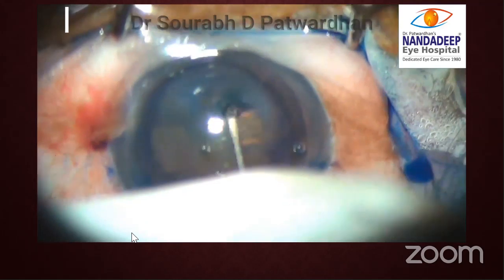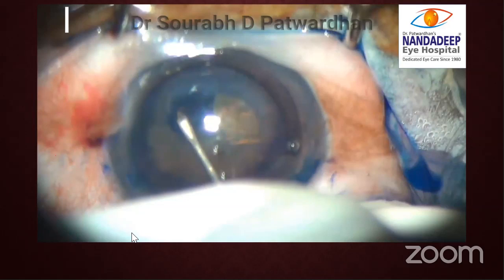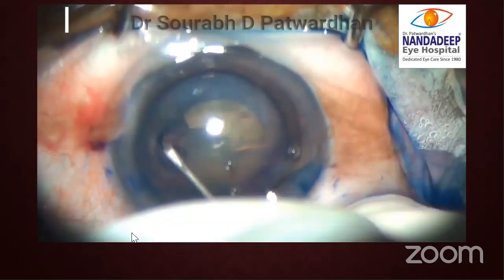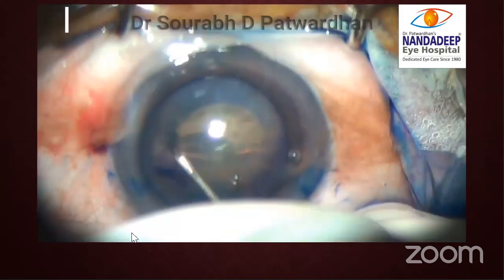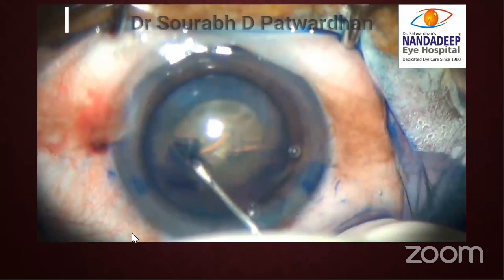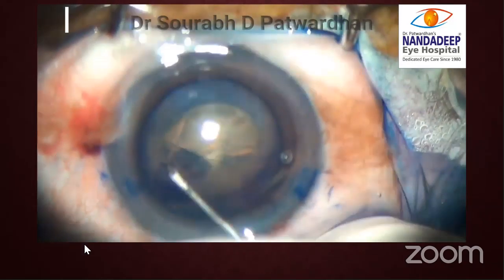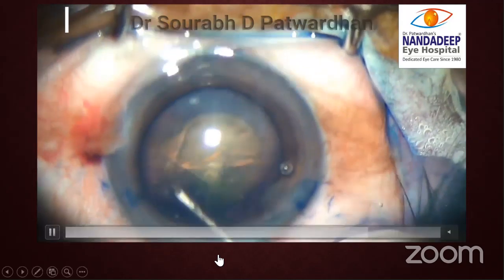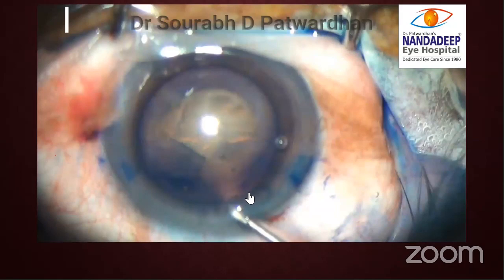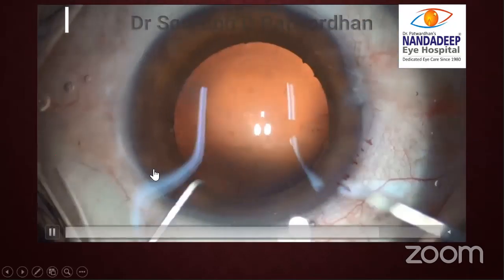And remember, which I showed you initially, when the anterior chamber pressure goes down, it cannot counteract the vitreous pressure and intralenticular pressure. And naturally, there is outward force which is acting on your capsulorhexis edge and which may lead to capsulorhexis extension. So this is the most common problem that you get when you start using the main incision.